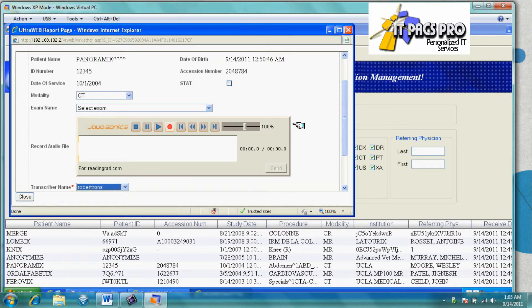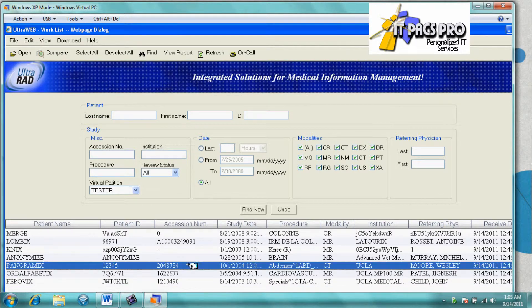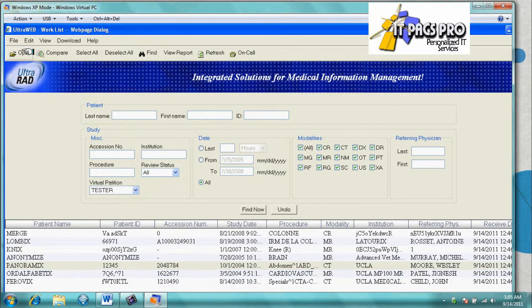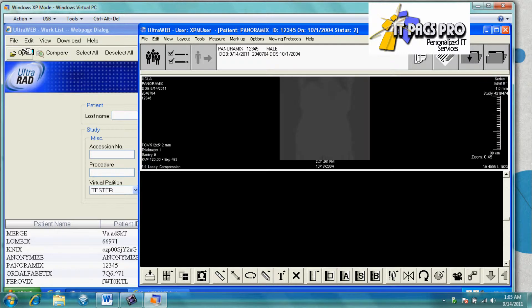We have immediate ability to dictate audio and send to the transcriptionist. We can also view our case, which would auto-open our report.